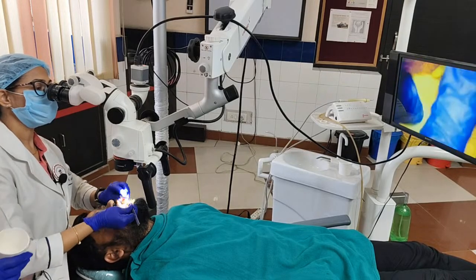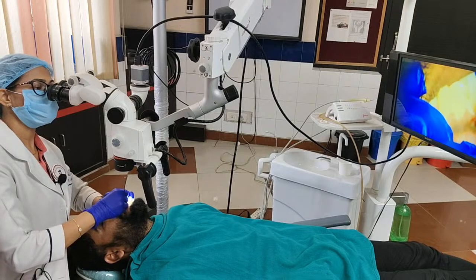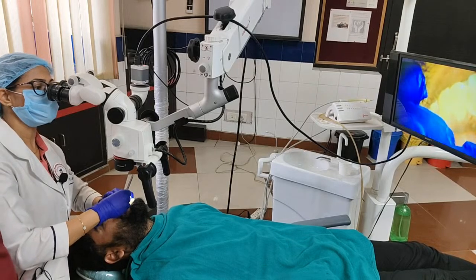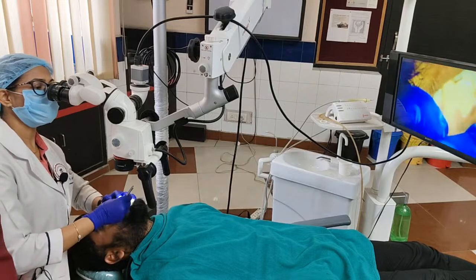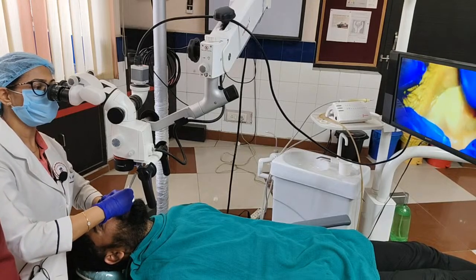Yes, ma'am. So what I was saying was we have to be careful while doing the procedure that we do not touch the bone. We do not have to denude till the bone because we already know that the melanocytes are present up till the basal layer only. So we are going to go only as deep as the epithelium, probably one small layer of the connective tissue. That's all, not more than that.